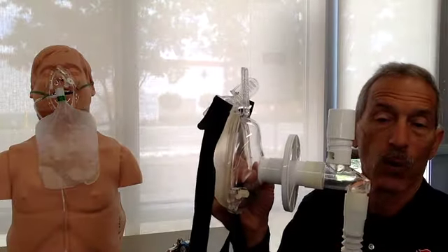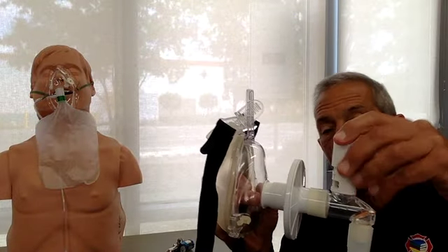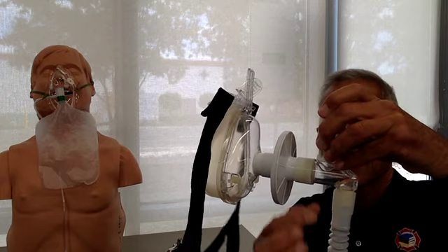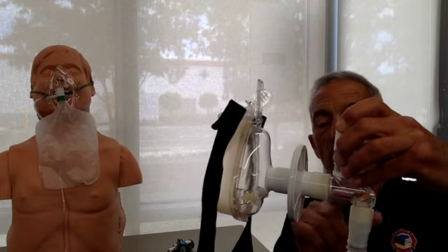Now, this is an older device. The newer ones in the field have another port right about here. It sticks down. It's got a little cap on it. And that's for providing this person with some type of inline nebulized treatment. Now, that's more of an ALS side of this. The medic's going to do that. They can measure out the medication, stick it in there, turn on the gas and all that and get things flowing. But that's another option with the newer devices anyway.